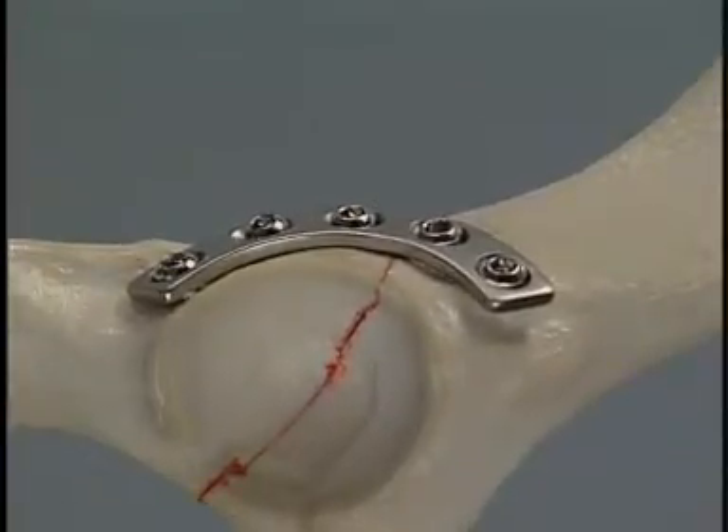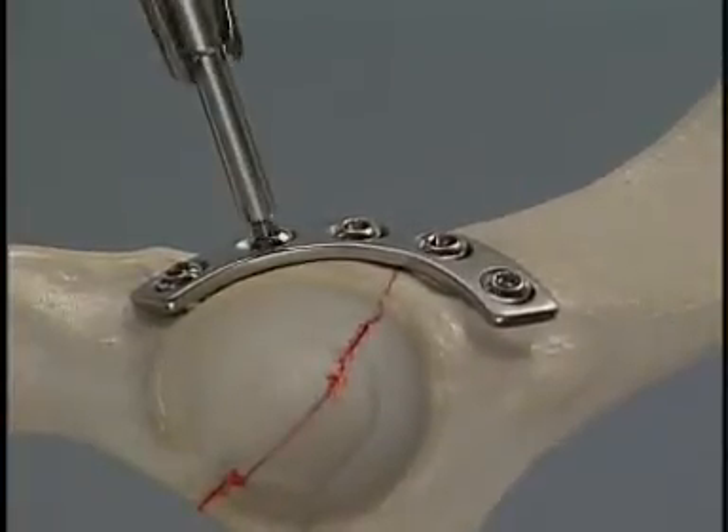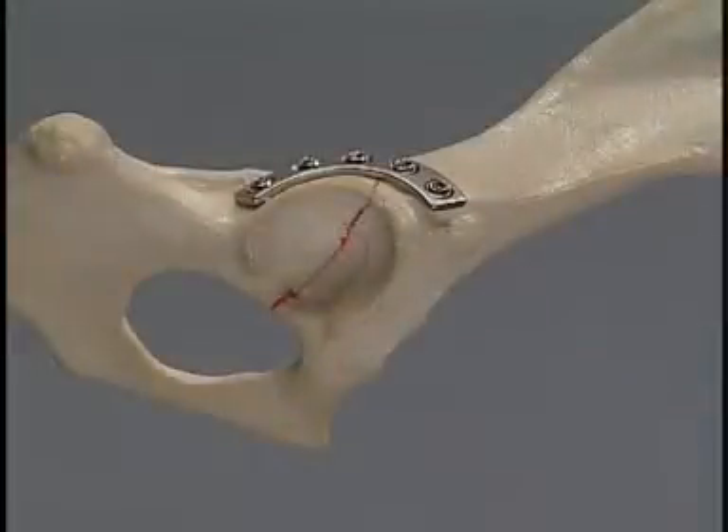After all the screws have been inserted, they are re-tightened. This fixation provides stabilization of the acetabular fracture.